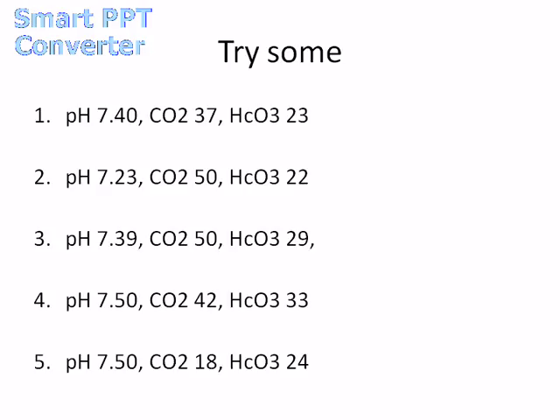So, let's see. It's less than 7.4, so therefore it's on the acidotic side, but it's in the normal range. So is the cause respiratory or metabolic? So the pH is slightly acidotic, and the CO2 is also acidotic.